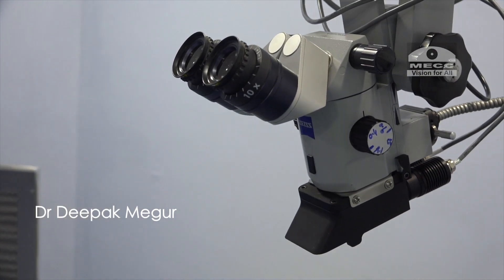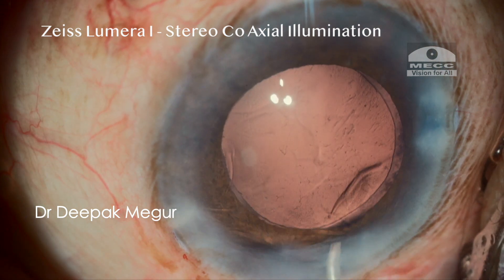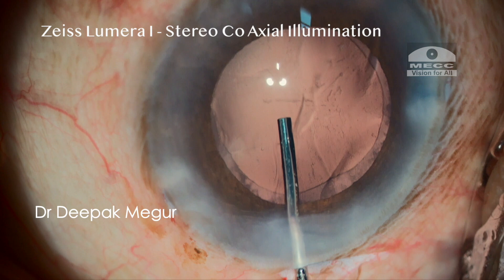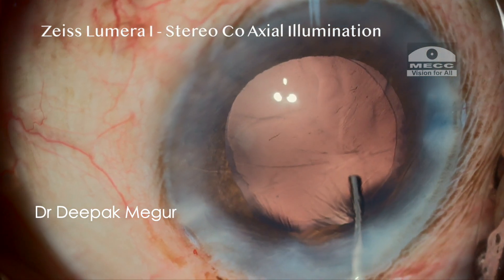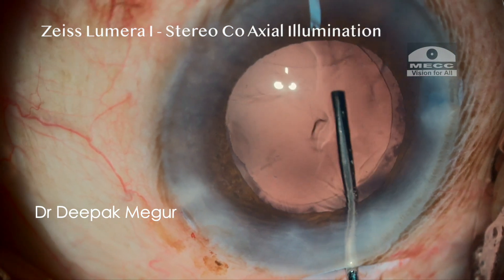Let me give a brief introduction about the principle of stereo coaxial illumination seen in some higher-end Zeiss and Leica microscopes. I have been using the Zeiss Lumera microscope since 2011 and I believe that this stereo coaxial illumination built into that microscope really changed the way we visualize during cataract surgery.